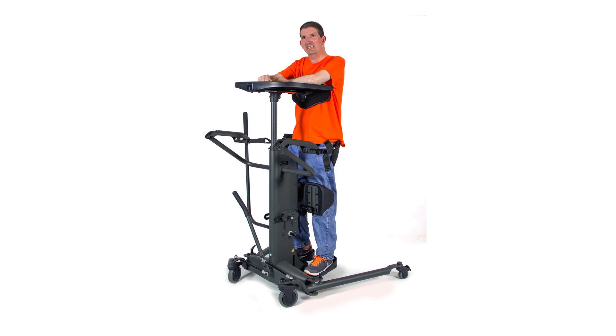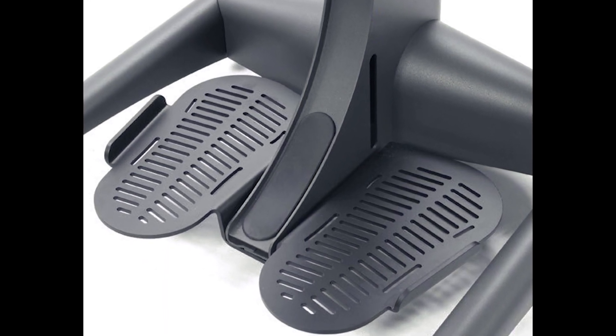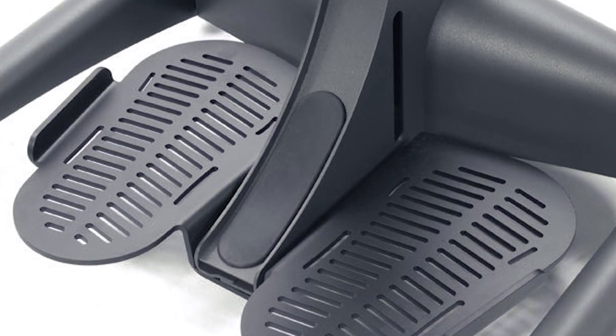Because they allow independent height adjustment, they are recommended for users over 5'10". The extra-large footplate accommodates larger feet, recommended for very large individuals nearing the weight capacity of 350 lbs.